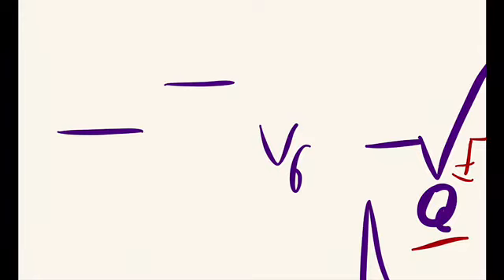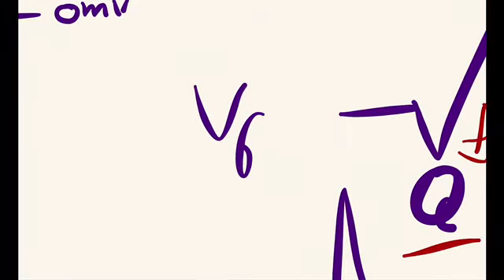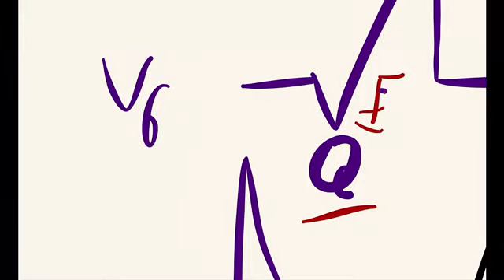Normally, because of the repolarized state of the ventricle, this baseline is at 0 millivolt. No problem. Now the problem starts when there is infarction, and there is death of the tissue.